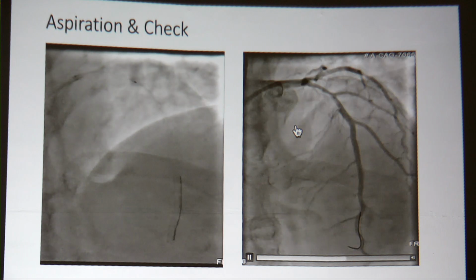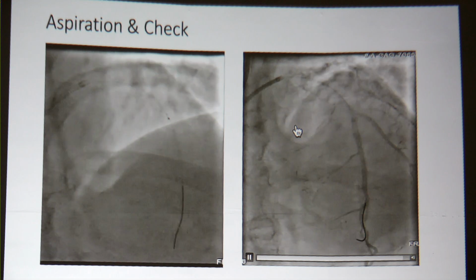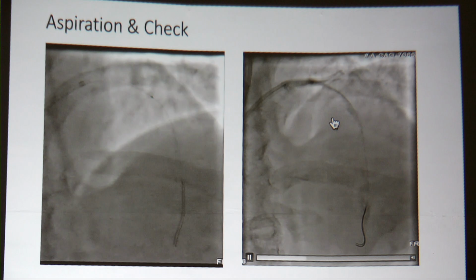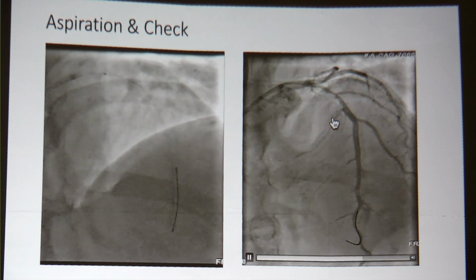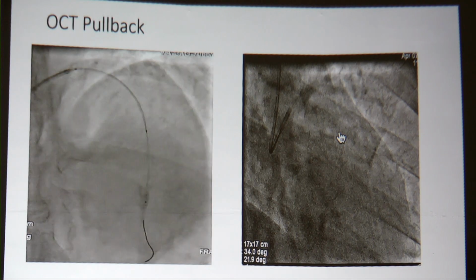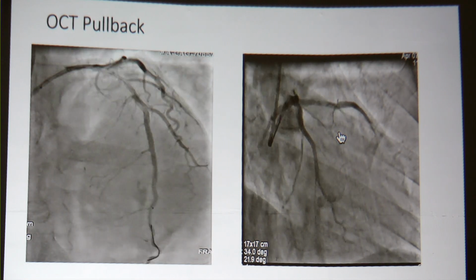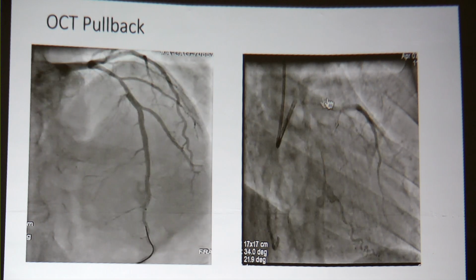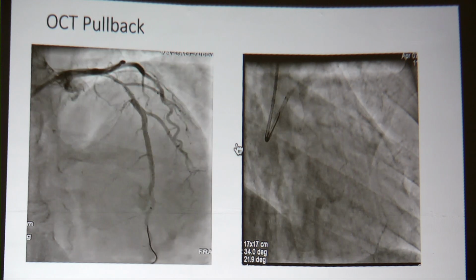So once you do this, what is the common phenomenon? The next reflex is, there is a narrow lumen there, so you go and stent this patient. But in such cases, where there is good flow and you are really not sure what is happening, look at the next angiogram and the OCT finding in this patient. It's not a very clear atherosclerotic narrowing that we are seeing there. So there is some doubt, so I did an OCT there.